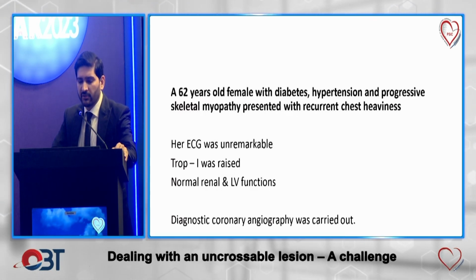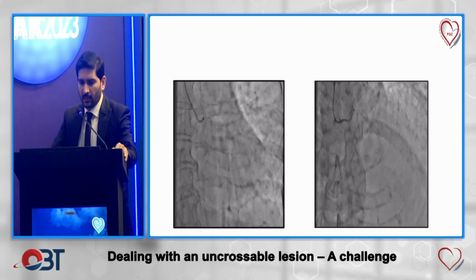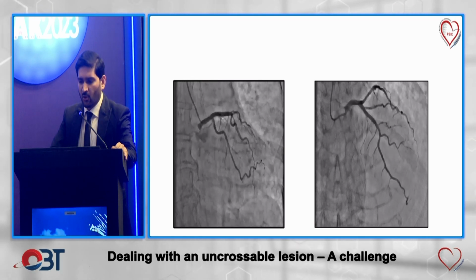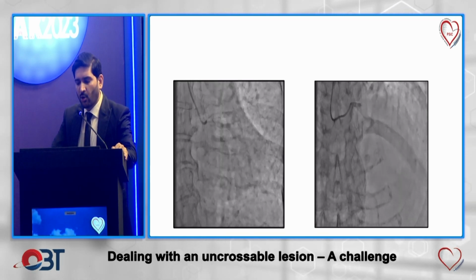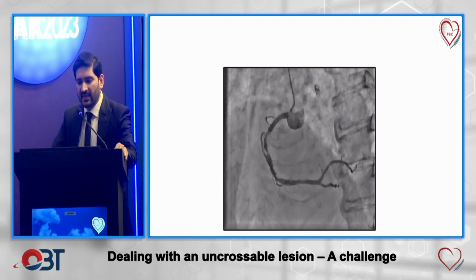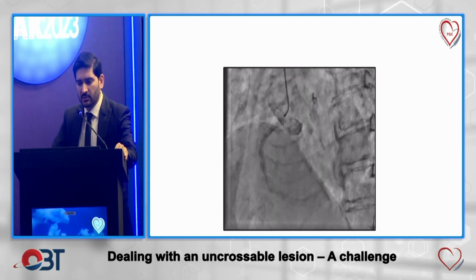Her diagnostic coronary angiography was carried out. You can see that the left main and left circumflex are normal, and there is a heavily calcified non-obstructed LAD. RCA was heavily calcified with critical mid-stenosis.